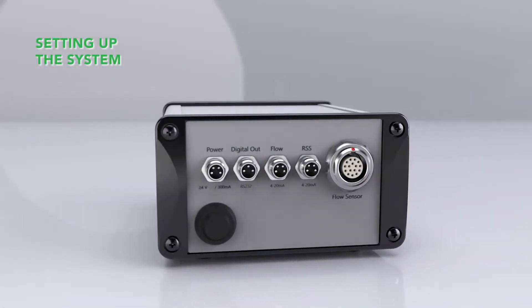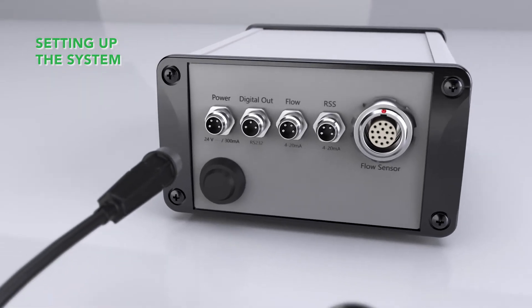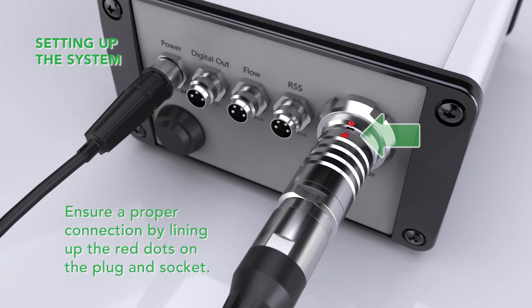All of the connections required to set up the system are located on the back of the device. Once the power supply is connected, plug the sensor cable into the designated socket. The red dots on the plug and socket must align for a proper connection.